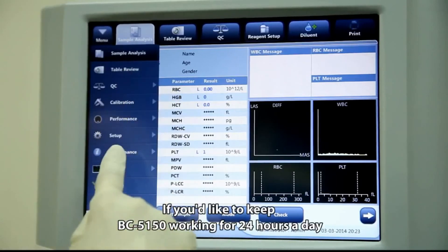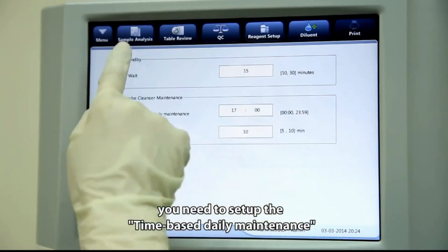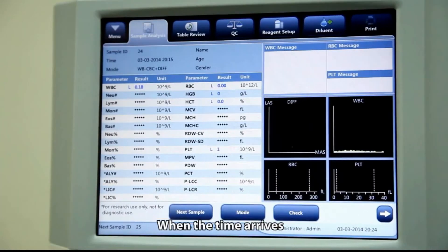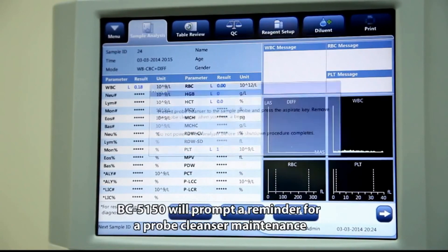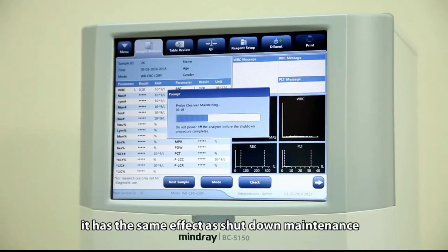If you'd like to keep BC5150 running 24 hours a day, you will need to set up the time-based daily maintenance. When the scheduled time arrives, BC5150 will prompt a reminder for probe cleanser maintenance, which has the same effect as the shutdown maintenance.